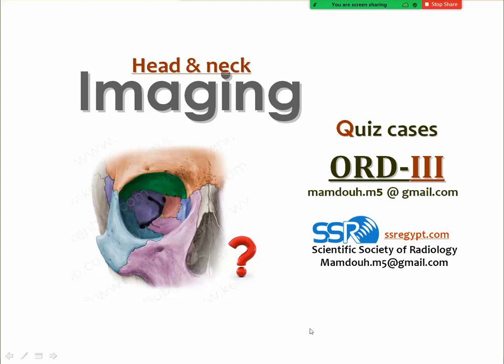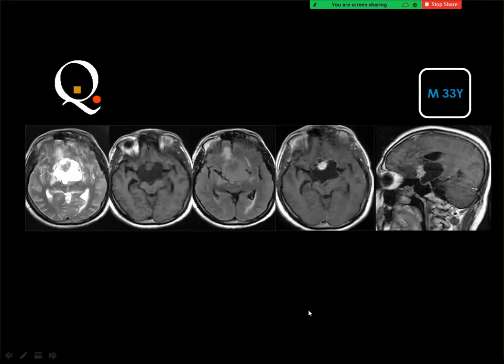This is a difficult subject, and it is not an easy module in the course of radiology, but we are trying to simplify matters as much as we can. And I hope you have benefited from the lectures that you heard before, and we will try to present some of the cases to revise your knowledge.